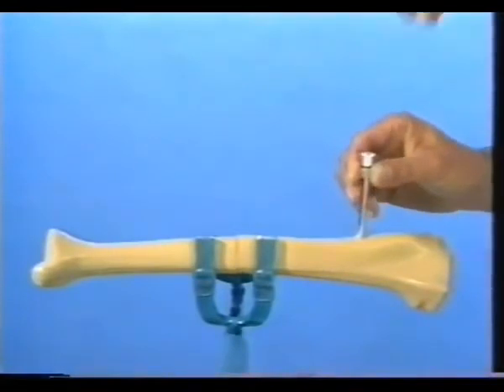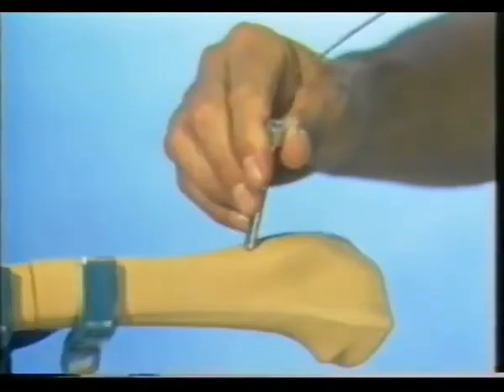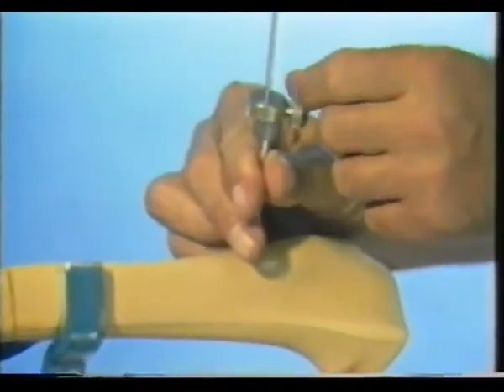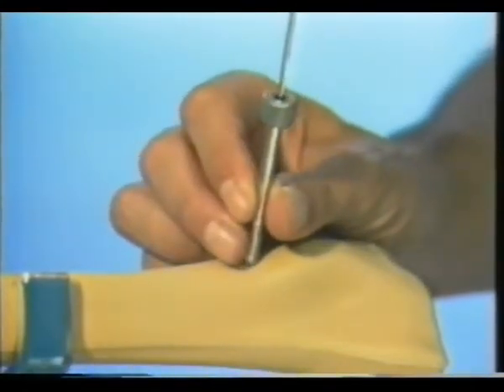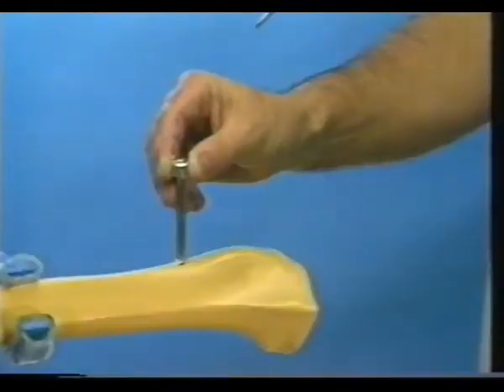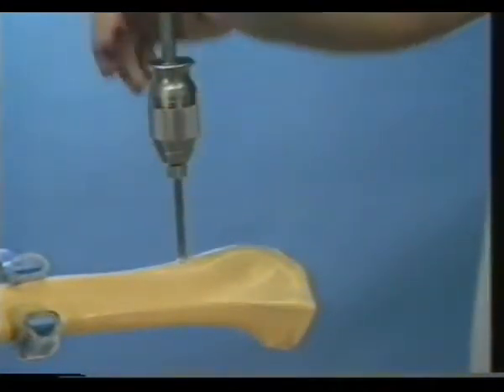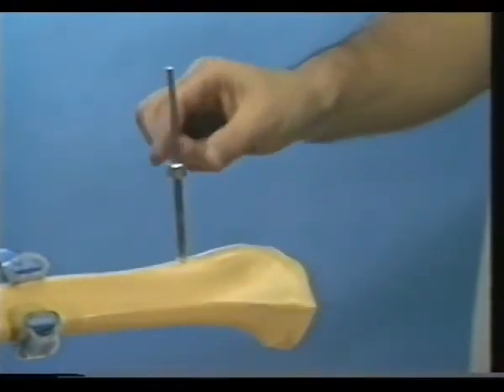Take out the inner sleeve and over-drill the nearer cortex with a 4.5 millimeter bit. Length is then measured through the drill sleeve using the special depth gauge. The nut is fixed at the corresponding depth and the Schantz screw positioned at correct depth in the chuck. The first Schantz screw is now inserted through the 5 millimeter drill sleeve. When the chuck butts the sleeve, the Schantz screw has the correct length. Remove the drill sleeve.